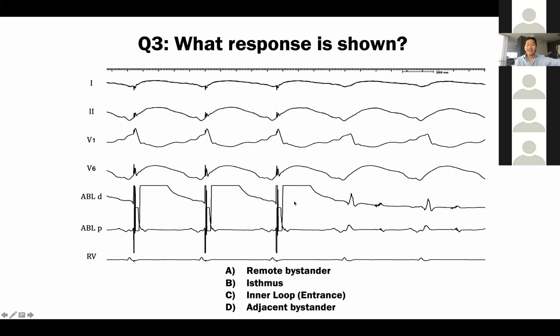So then the last part, which goes to Phil's question, and of course Phil's very specific, is how do you rapidly know which one it is? Well, I'm not going to rapidly be able to tell this one because this is tough, but let's go through this slowly. Here, there are 2 electrograms of interest, this one and this one. Larger amplitude, lower frequency, lower amplitude, higher frequency.